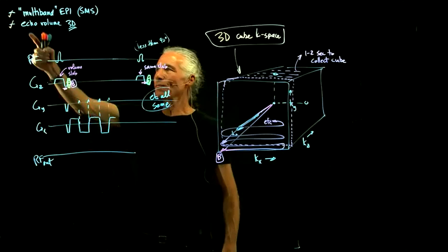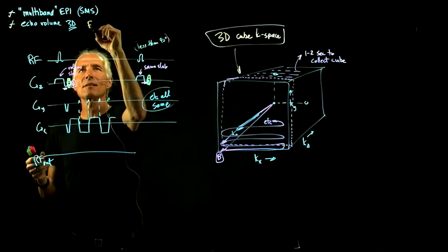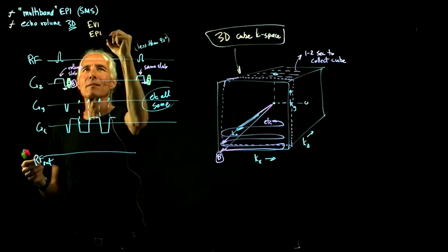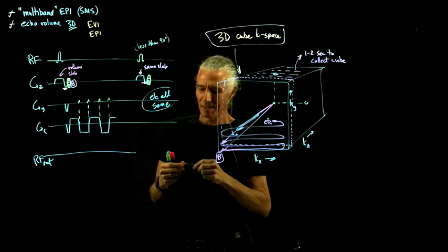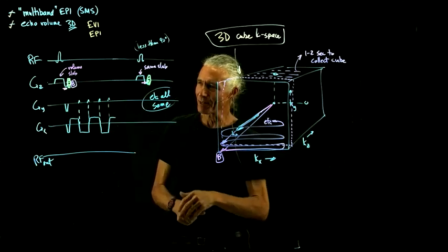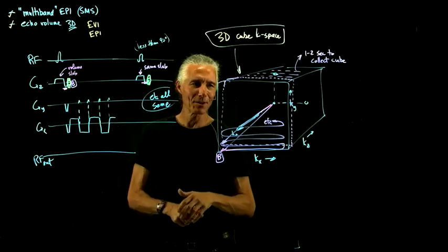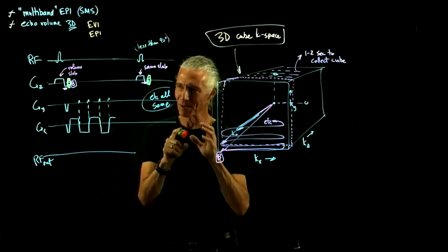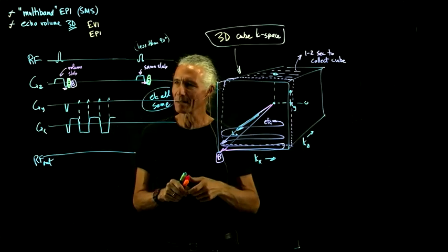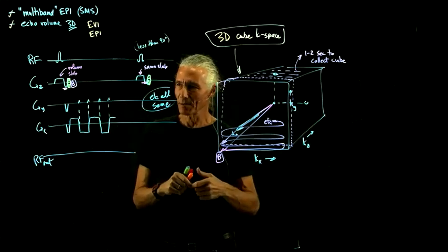Okay, so that's echo volume imaging. I mean, they named it that so that it looked like EPI. So it's, you know, echo planar imaging, echo volume imaging. And we have this on a scanner too, if you want to do that. So, like I said, it's the wave of the future. It always will be, probably. But no, somebody will eventually sort of figure out how to deal with the motion artifact in it. And it potentially could be like another doubling of your signal to noise.